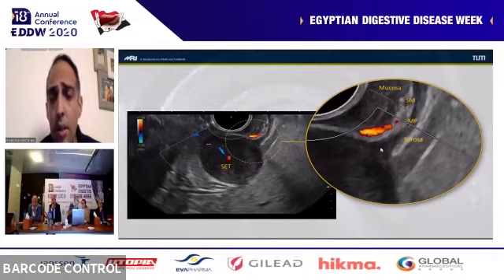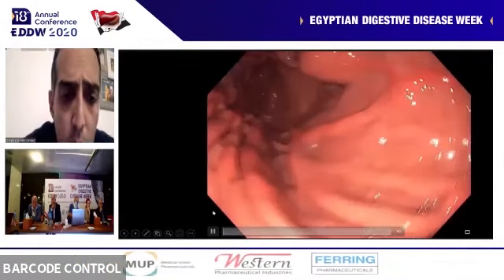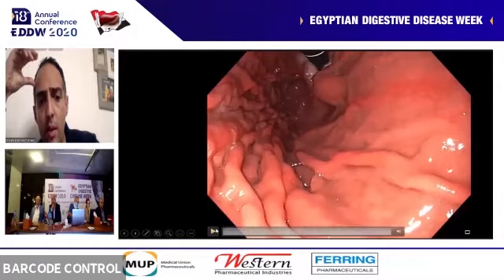The patient refused any biopsies or punctures before the procedure. She wanted to remove the tumor. I also have to say that this lesion should always be discussed in an interdisciplinary tumor board with surgeons, pathologists, and radiologists. I will try to play the video now.